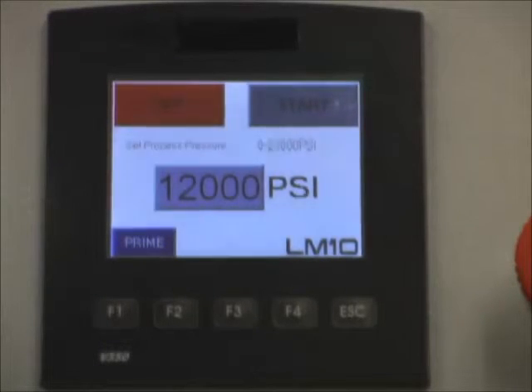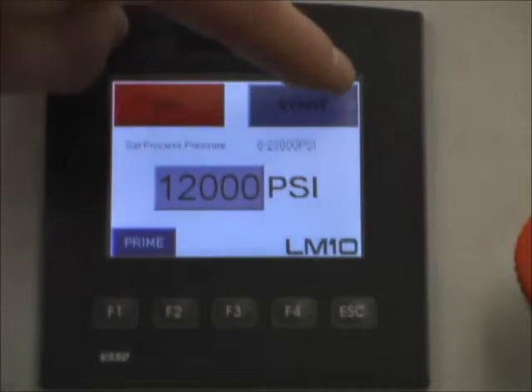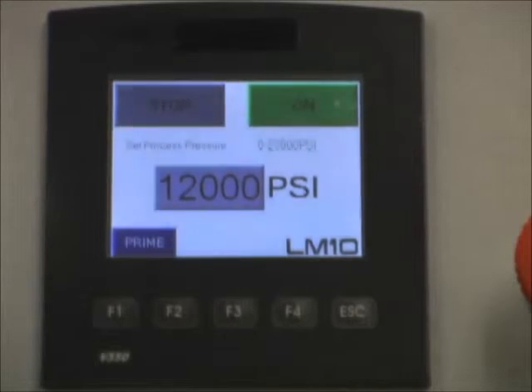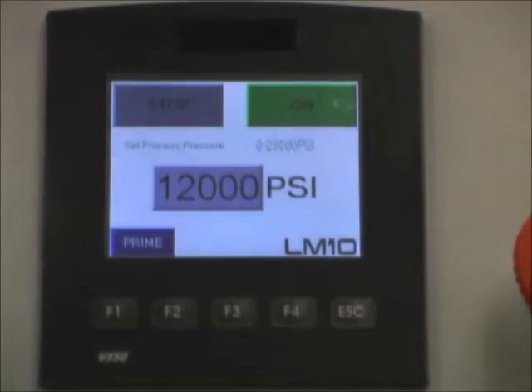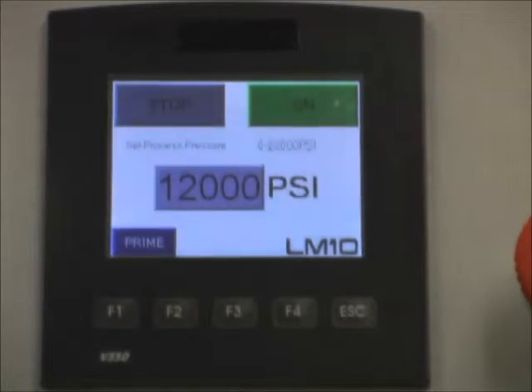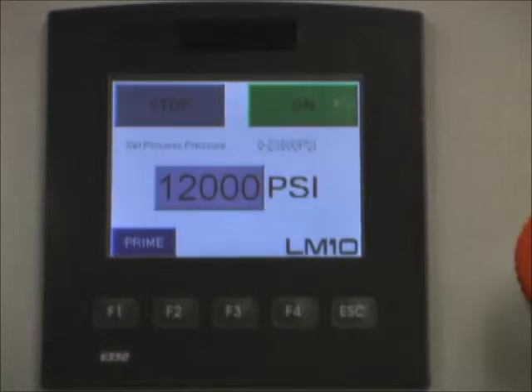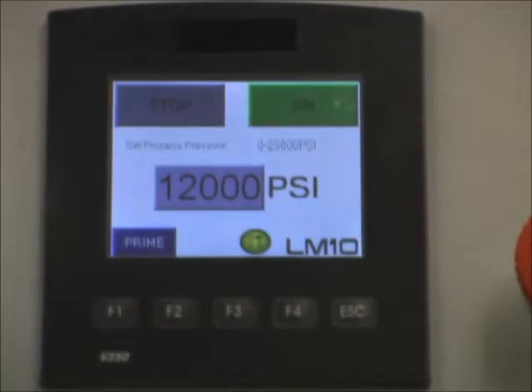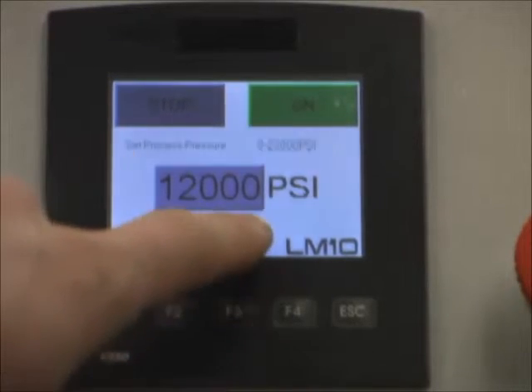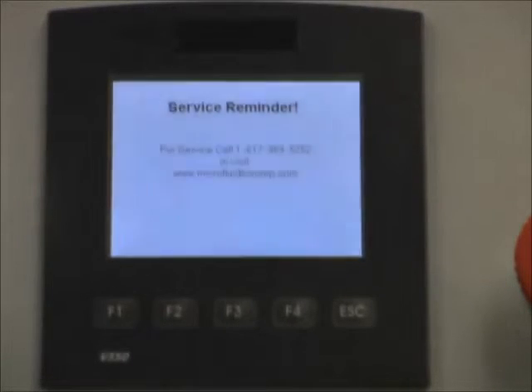The next function of the LM10 is to alert the user that it is time for maintenance. We will start the processor, and at a set number of cycles of the plunger, a little yellow light will illuminate to tell the user it is time for service. You can see the little yellow light, and if we touch it, it displays just a service reminder.